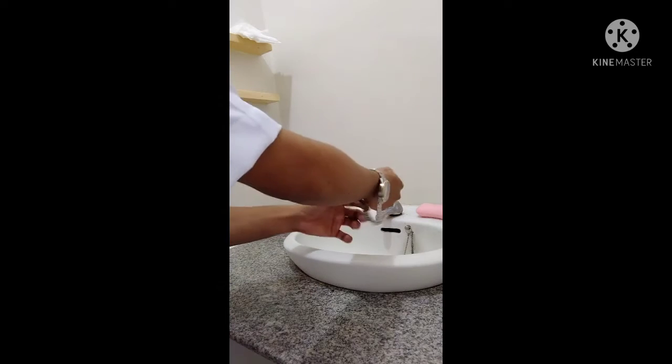Prior to doing the procedure, we need to of course wash our hands before preparing the set. It's actually to deter the spread of microorganisms.